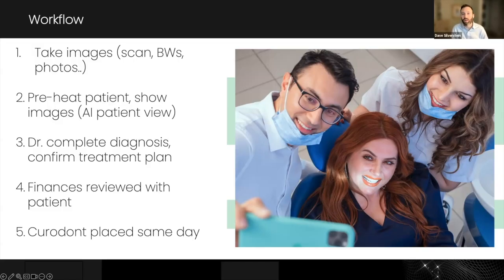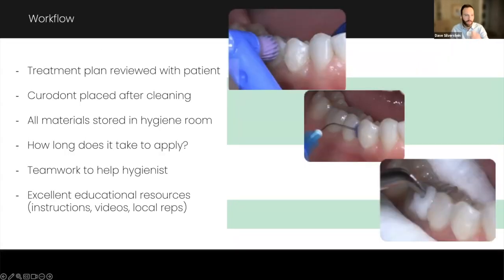It is very rare that we would ever schedule a patient to come back for that unless the patient was like, oh my gosh, I really have to get out of here. Like I need to leave right now. And I don't recall the last time that's happened, but I'm sure it does happen from time to time, right? So the treatment plan is reviewed. The Curodont is placed after the cleaning. Like I mentioned before, all the materials are kept in the hygiene room. It takes just a minute to place this.